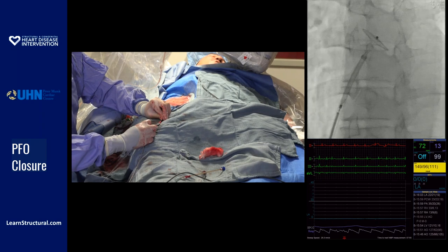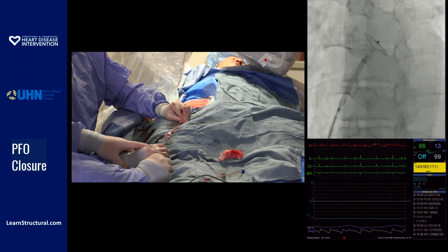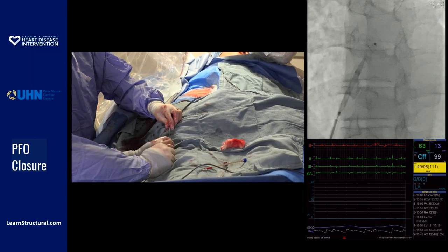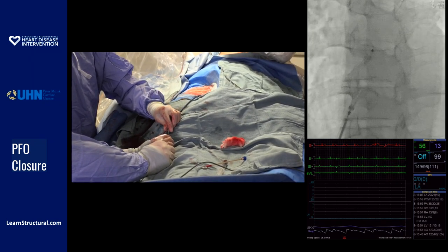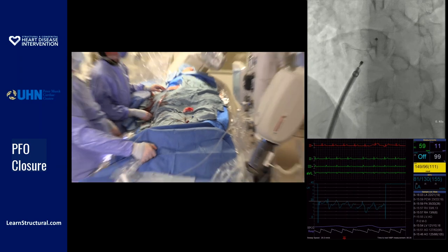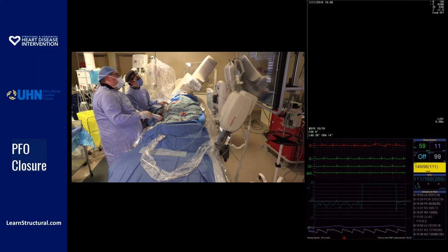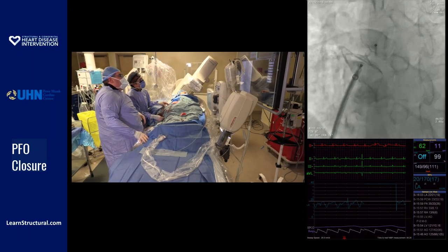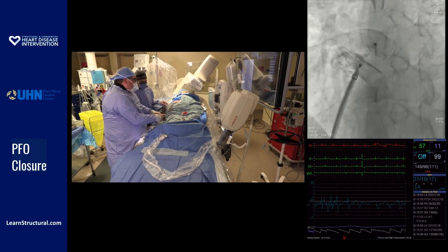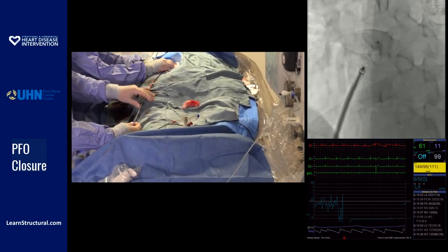So there you're up against something — that's good. Now hold the cable, and just pull the cable here, put your hands here, and just pull back the sheath. And just advance the cable slowly. Very nice. You can see that the bigger disc is on one side of the contrast. So I think everything looks pretty good. What we'll do is push the sheath up against the device — just hold it there.